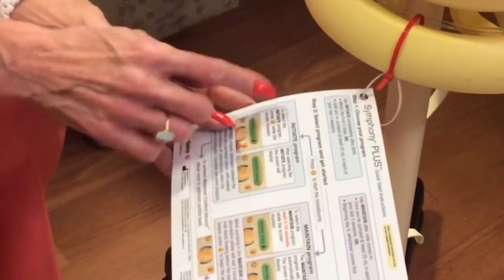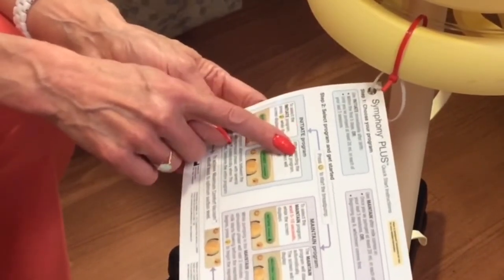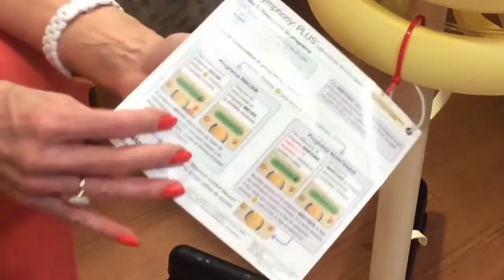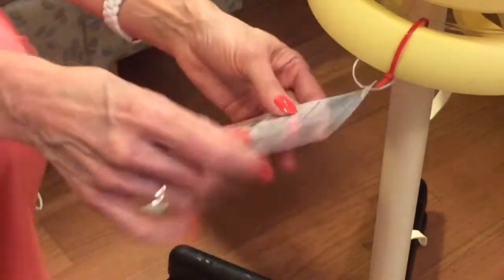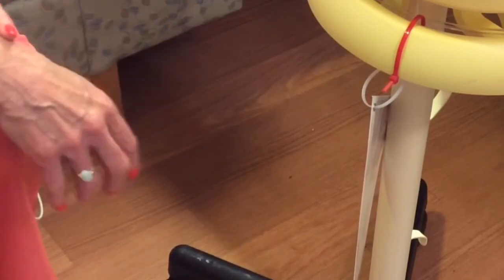There are instructions hanging off of every pump on how to use the initiate and maintain programs, which I described in this video. On the other side, they're in Spanish. If you have any questions, please direct them to the NICU lactation consultant or your nurse.